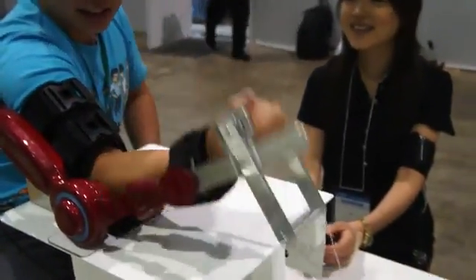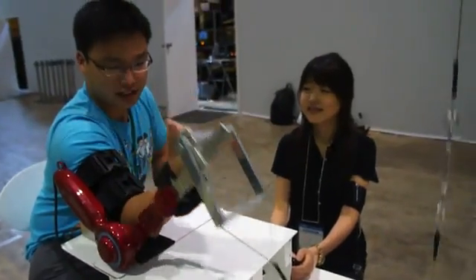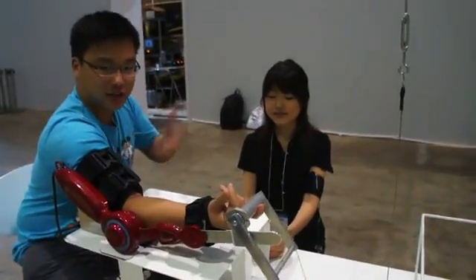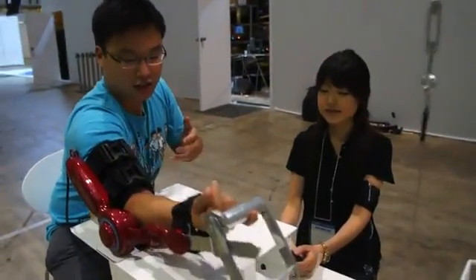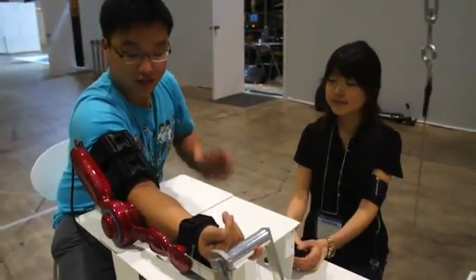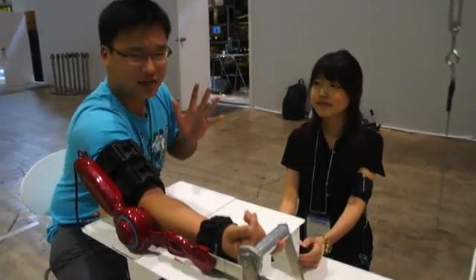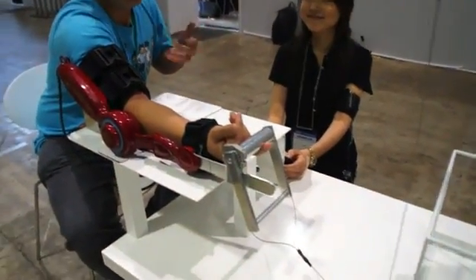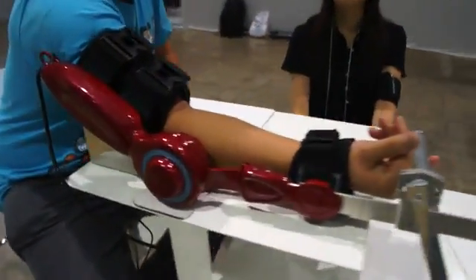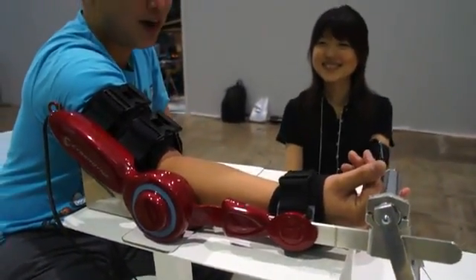Anyway, this is very good for those who need extra assistance if they have illness in their muscles and things like that. This is very effective, and eventually they'll be releasing a full bodysuit, and we might see something new at CES 2012. So we'll keep an eye on that, and you'll know as soon as we do. Cyberdyne's robotic arm.